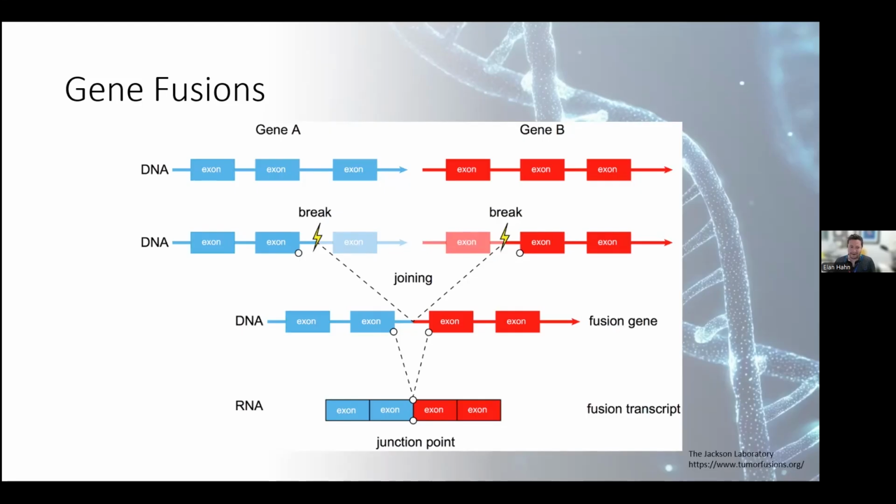Additionally, with RNA there's an element of expression, so when a fusion transcript is expressed highly by a cell, we will see more of those fusion reads as well.